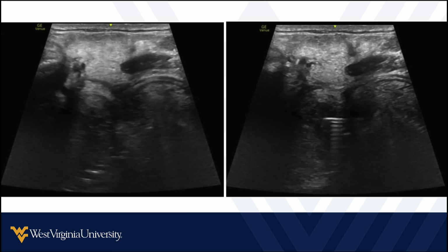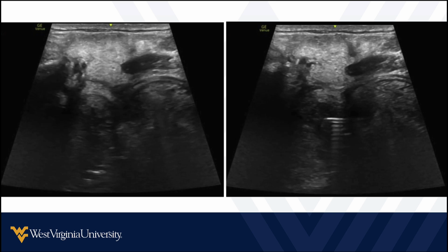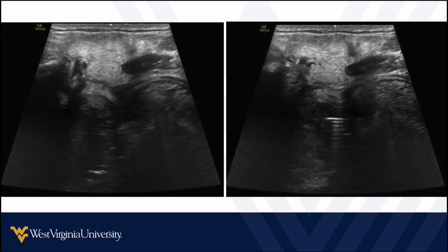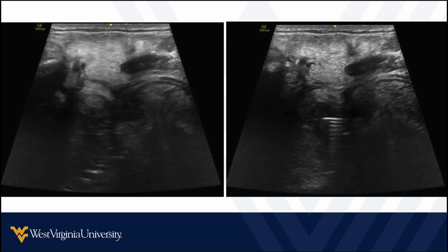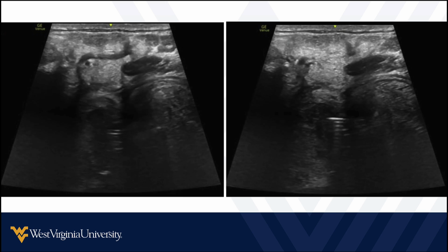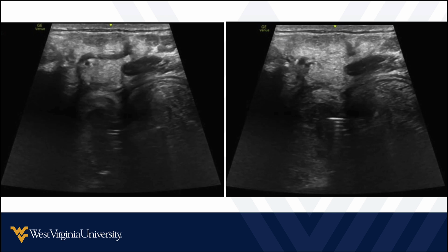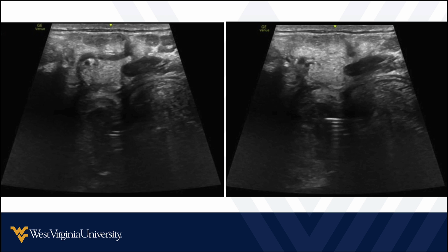And then by using this technique, in this case, what was done was an ultrasound-guided and triangulated drainage. This has been called the telescopic approach, where the ultrasound is external. You get the patient's mouth open, and then you get your 18 gauge spinal needle, what we typically like to use, and get it into the abscess cavity, and you should be able to watch it with the ultrasound from the outside, confirming you're in the right spot, and then suck all that pus out of there. Super satisfying. These are great procedures. Patients feel a lot better after you're done with this.